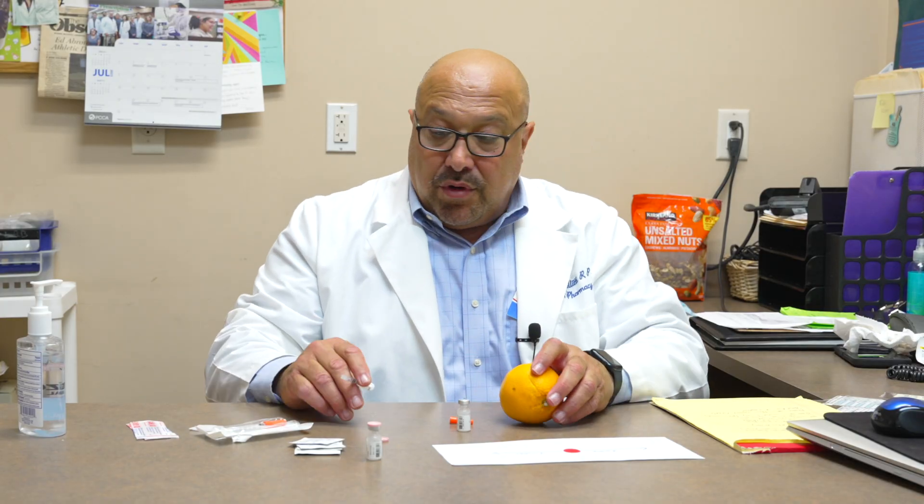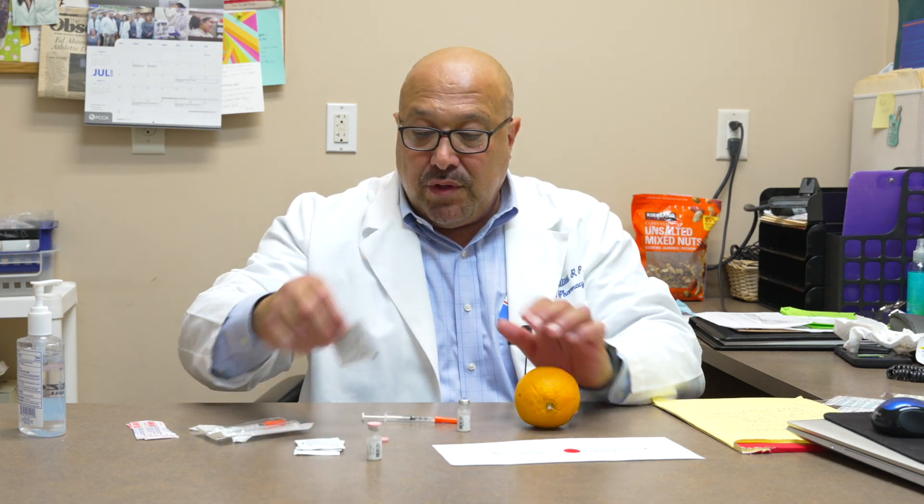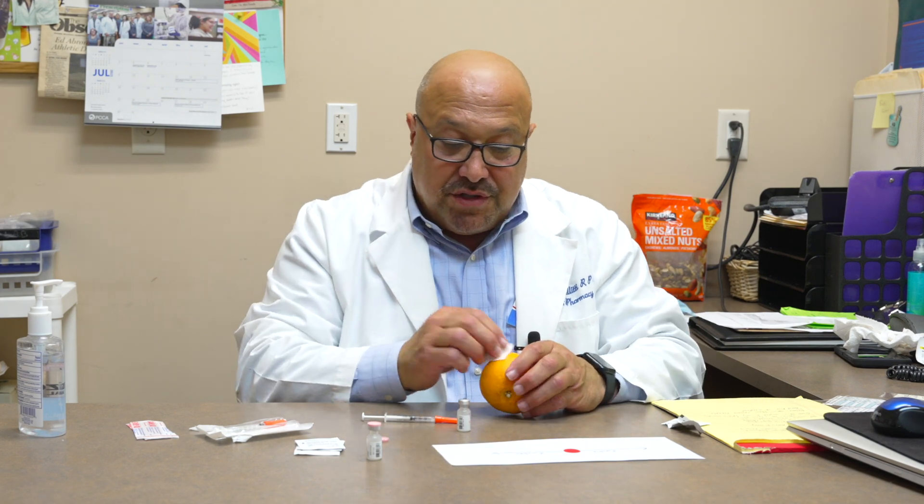Then you take the needle back out and you are ready to inject. Put the cap back on the needle to prepare your injection site. Get another wipe — this orange is the lucky victim today. Normally a person is going to pinch the skin: pinch the area around your stomach, your outer thigh, or if somebody else is giving it, pinch the area around the back of your arm.